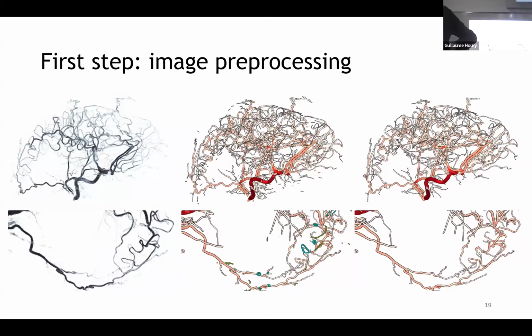So what they do is that the patient lies on the table, and you take a first CT scan. So you get an image where you have, for instance, the skull, the bones. Before taking the image, you turn off the respiratory system, so the patient lies completely still. Then you take the image, then you inject a contrast agent, which makes the blood opaque to X-rays.